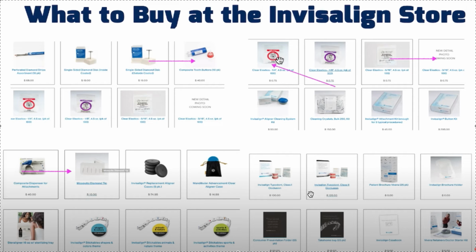Only other thing you might want to get would be, they have these Typodonts. I would get, no sense in getting a class 1 one. I think they have a class 2 one. This is it right here. It's a little bit more. But the benefit of the class 2 one is that it already has buttons on it, and it already has elastics in the bag, so you can show how to put elastics on and off and things like that. And they also have an MA one.